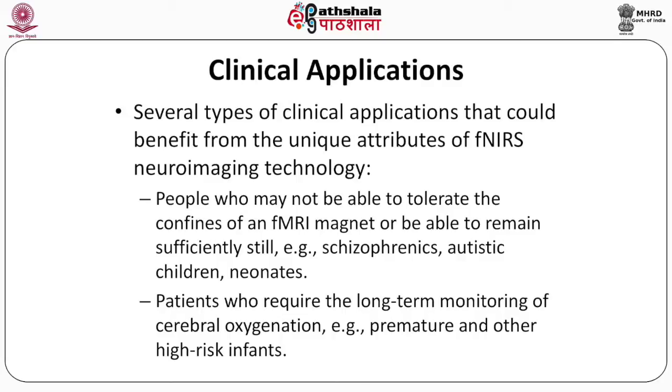Patients who require long-term monitoring of cerebral oxygenation, like for a very long period of time, it is very difficult to maintain the patient in a still posture. So, in those patients, we use this FNIRS technique. Example: premature and other high-risk infants.